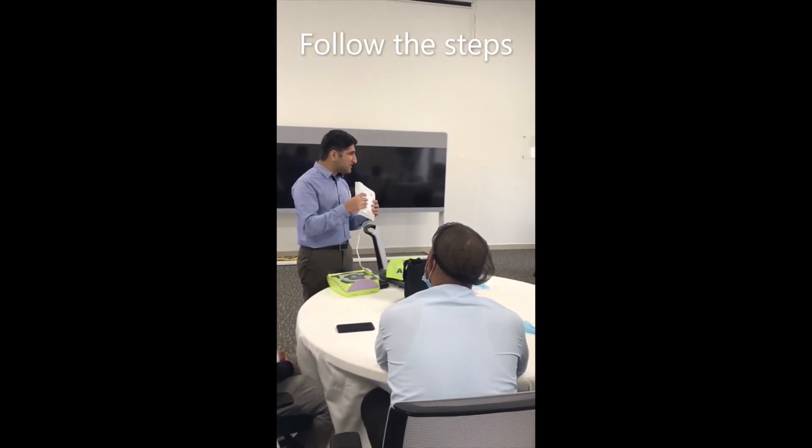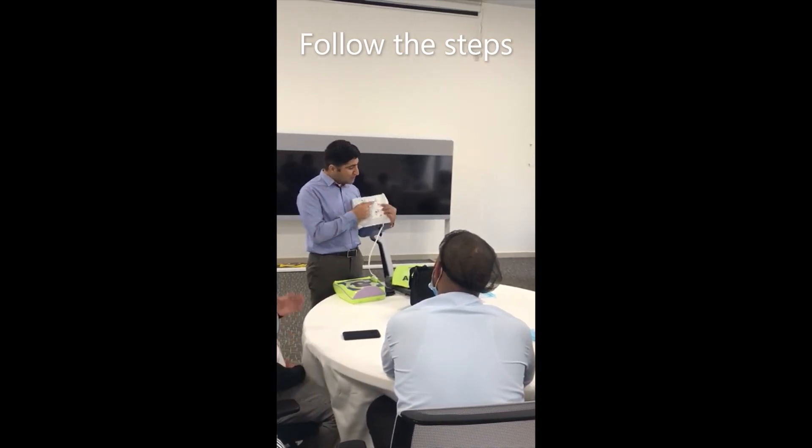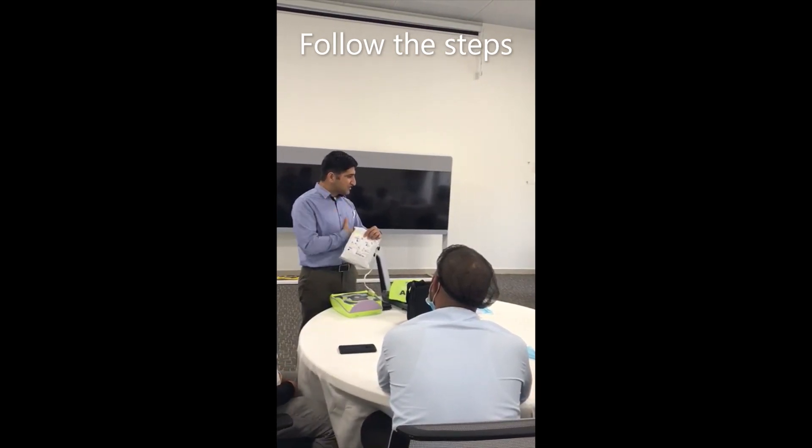It is saying: remove the pads from inside and attach them on the body of the casualty. One pad placement is already mentioned here — one pad will be on the top right and the other will be on the left side. You need to stick these two pads.